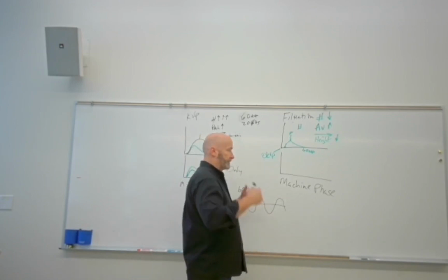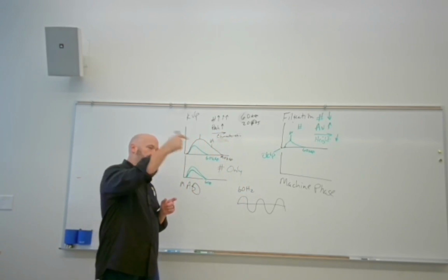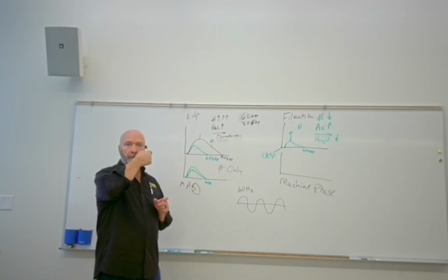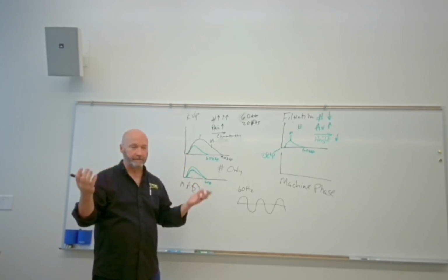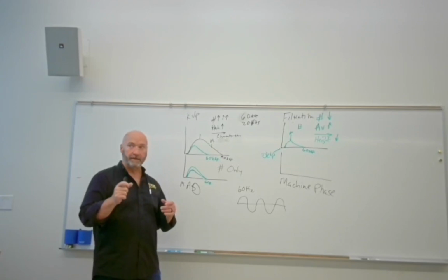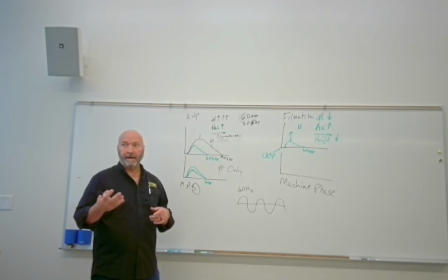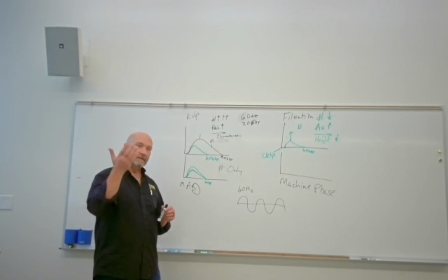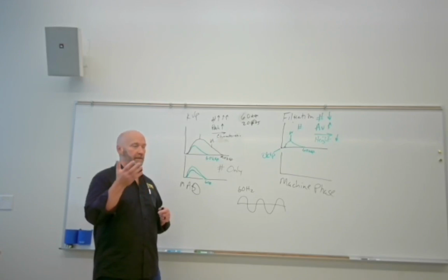That's bad for the X-ray tube because we want to send electrons from cathode to anode. If you remember the anodes that I sent around last year, one of them was pretty badly melted. It had a thin layer of tungsten, but as soon as they burned up the tungsten, it got into the copper underneath.